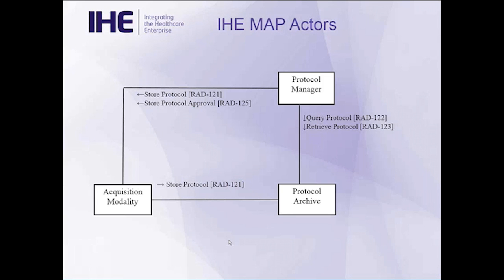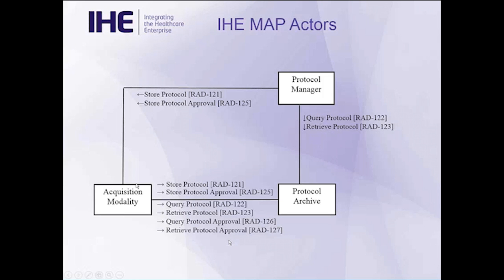So just to close the seminar, this is the basic flow of transactions that we saw at the beginning from the modality. You store to an archive, the protocol manager can query retrieve and then pushes them back out. With these other use cases, in addition to storing protocols, you can also store protocol approvals, and then you can do query and retrieves of both protocols and approvals. That lets the modality, for example, consult a library.